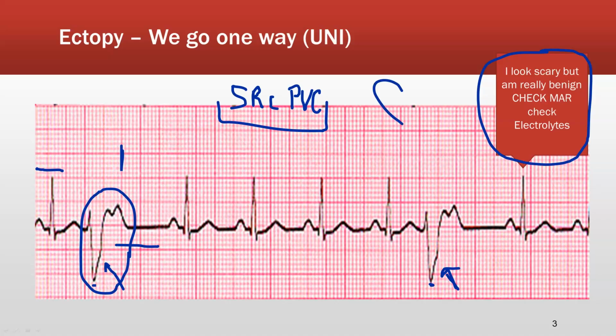Just to break it down here real quick. We said it's going to be a signal originating in the ventricles. Generally speaking, because these do look fairly consistent with one another, we have the SA node up here, and the AV node right here. Once that system fires and you get these QRSs, you're going to have another area in the ventricles that causes this aberrant signal to come earlier than we would have wanted it to. But your heart wants to beat in a rhythmic pattern.